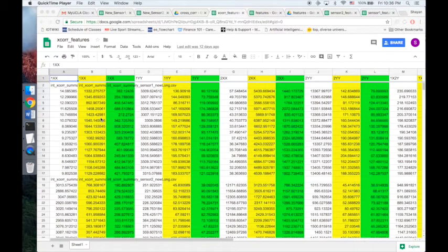This file represents the integrated xcorr summary files which were collected for the autocorrelation of the file indices 00, 11, 22, going all the way to 1414. Those rows were collected for each of the three types of motion, being short, long, and sitting. Here the white columns correspond to short, yellow columns correspond to long, and green columns correspond to sitting.